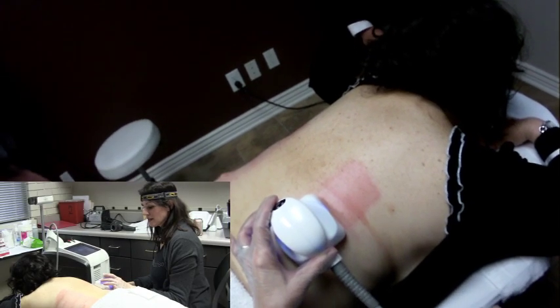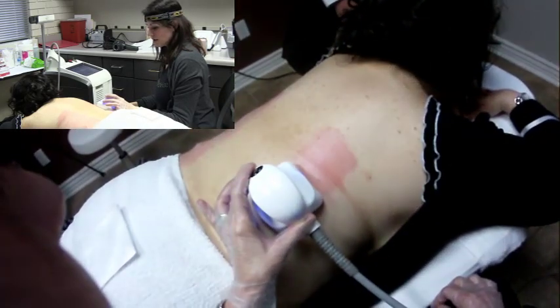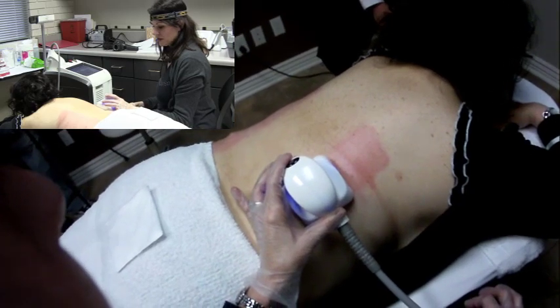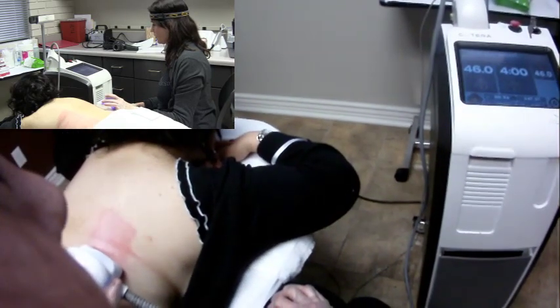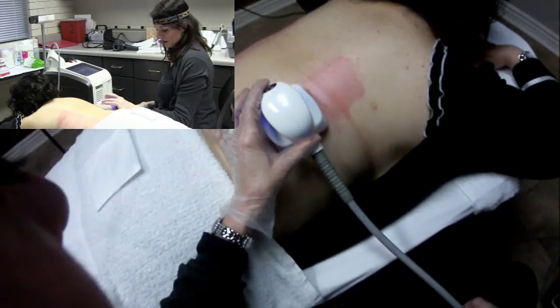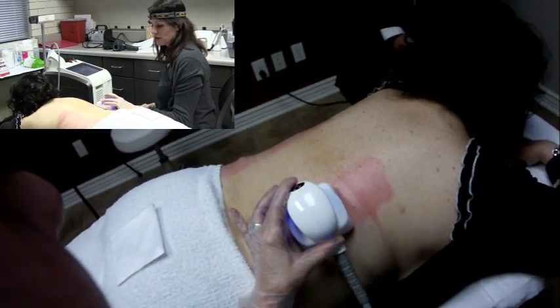Hi, this is Chris Groop with Aesthetic Advisor Laser Academy, and we have got something really wonderful to share with you today. This is the Cutera TruSculpt radio frequency for fat reduction. I know you're all thinking, oh my gosh, I wish I was the person lying on the table — and you know what, I do too.